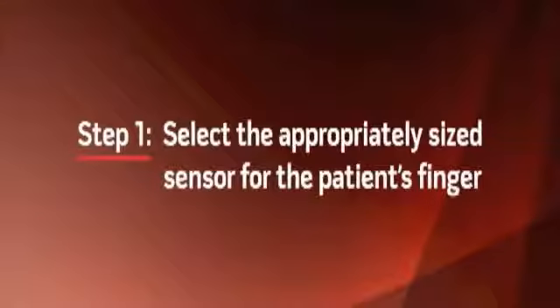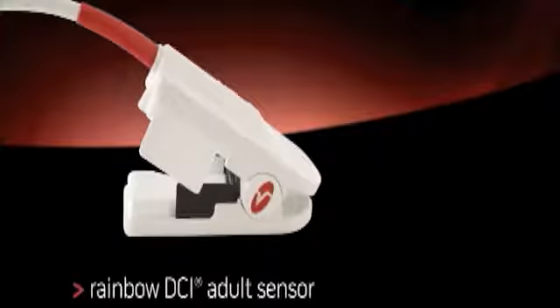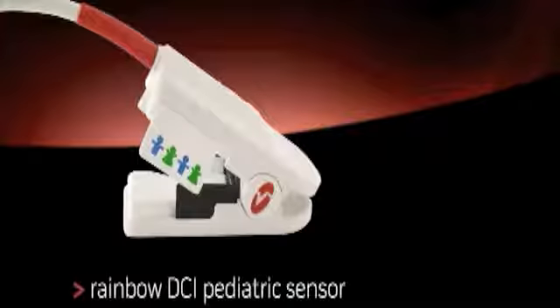There are several simple but very important steps you must follow for proper rainbow sensor placement. Step 1: Select the appropriately sized sensor for the patient's finger. For adults with average to large sized fingers, use the adult sensor. For patients between 10 and 30 kg, and for adults with slender fingers, use the pediatric or small finger sensor. The rainbow sensor should be used on fingers only. Using the rainbow sensor on toes or earlobes, even on pediatric patients, will cause inaccurate readings.